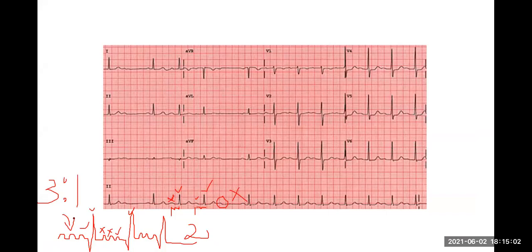Is there any particular lead that we look at for conduction? Again, lead 2. So write that down. For rhythm and conduction, the best lead to look at is lead 2.